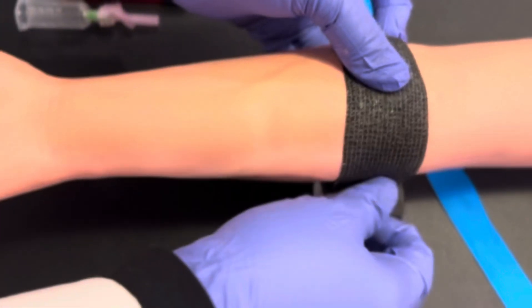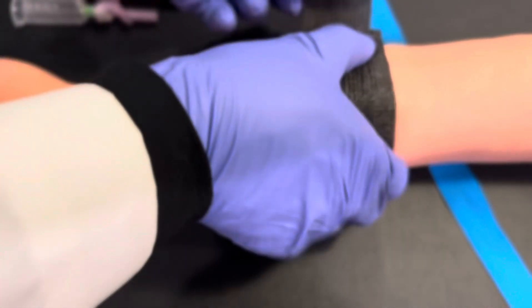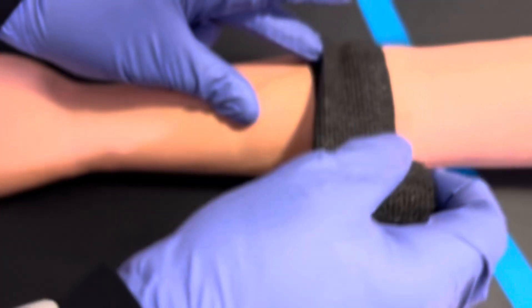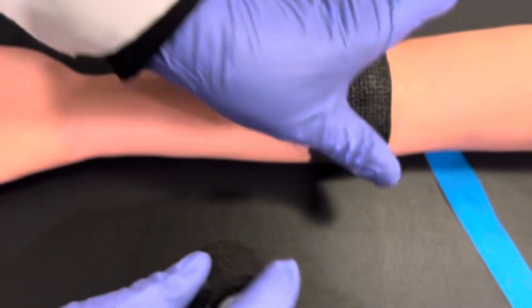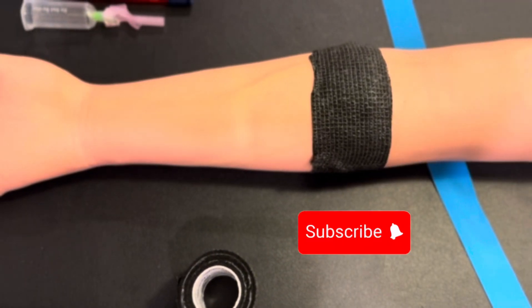Wrap the site with a coflex bandage to complete the venipuncture procedure. Thank you.